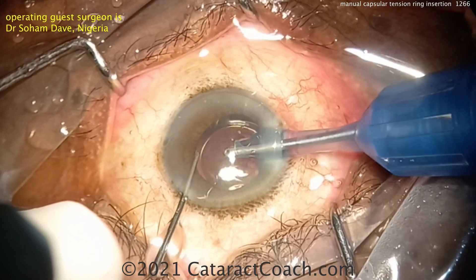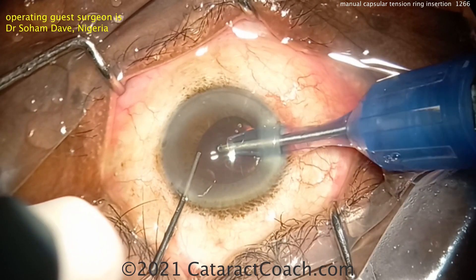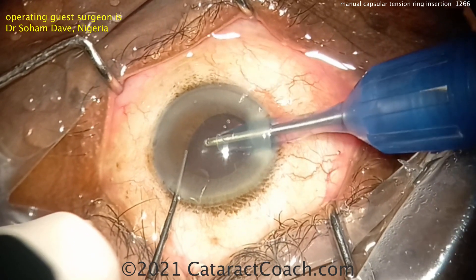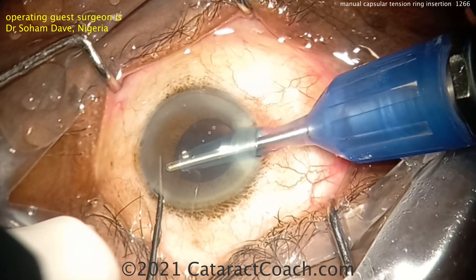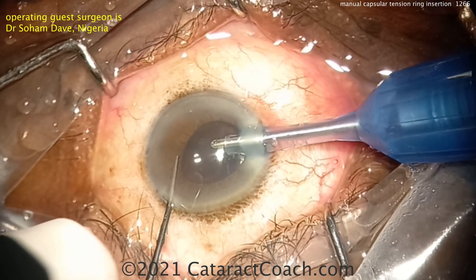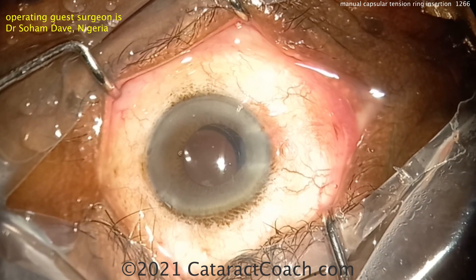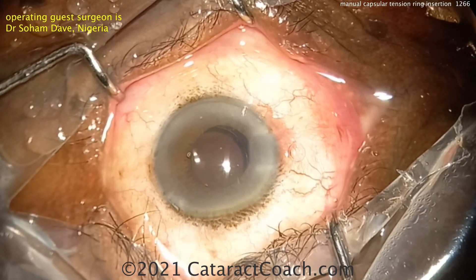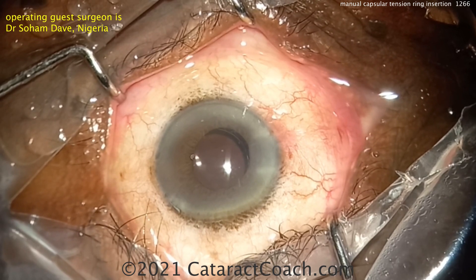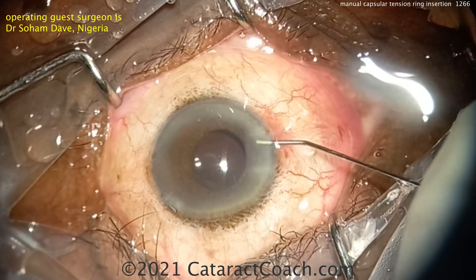We've seen other videos from Dr. Dave here on CataractCoach — check those out. He's obviously a very talented surgeon with a thriving practice and a wide variety of interesting cases. You'll notice he's using a temporal incision while sitting superiorly. Keep in mind that when operating on the patient's other eye, you may need to switch hands for the temporal incision. If you have a case that needs a CTR, you don't have to have an injector — you can put it in manually and it'll turn out just fine.